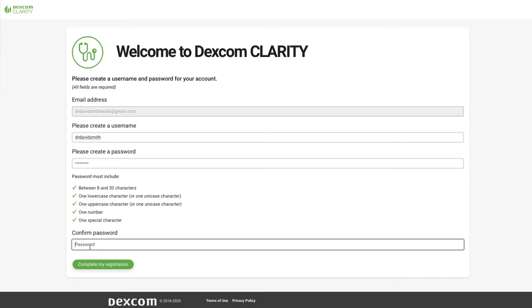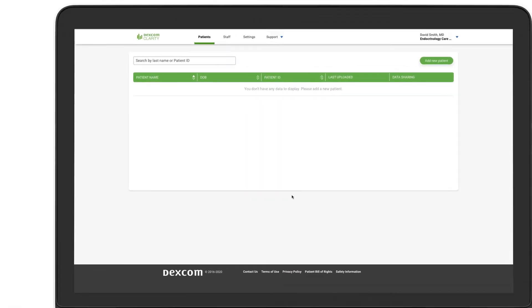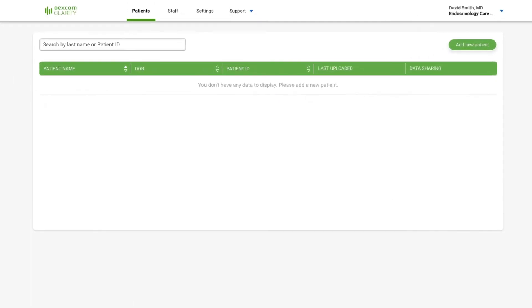Create your own username and password for the clinic account, then click Complete My Registration. You've completed the clinic registration and created your administrator account. As an administrator, you can authorize access to patient data by adding Clarity staff accounts.